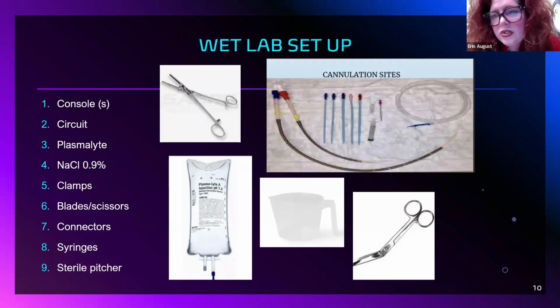Some people have it worked into a tray. A lot of the facilities that I have worked at over the years, we had a tray. We had a tray for initiation, and then we had a tray for change outs. So it was much more abbreviated. Those types of things also help, because when you're trying to move as fast as possible to fix a problem on a critically ill patient, you have to streamline. Streamlining is extremely helpful with that.